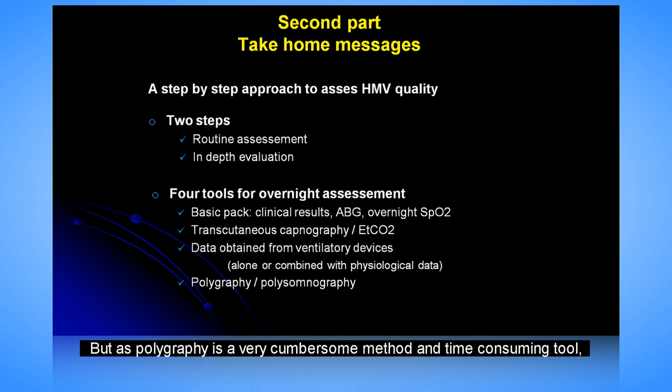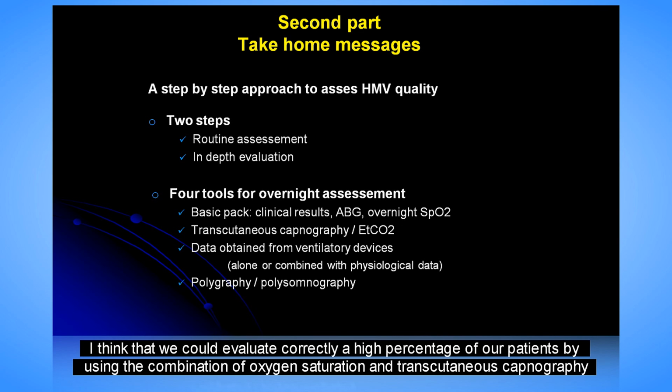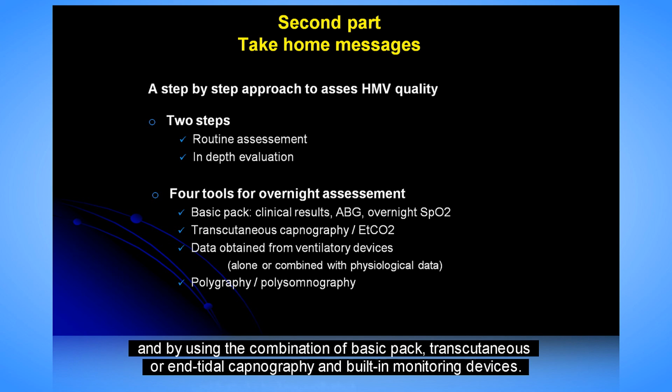But as polygraphy is a very cumbersome and time-consuming tool, I think that we could correctly evaluate a high percentage of our patients by using the combination of the basic pack, transcutaneous or end-tidal capnography, and built-in monitoring devices.